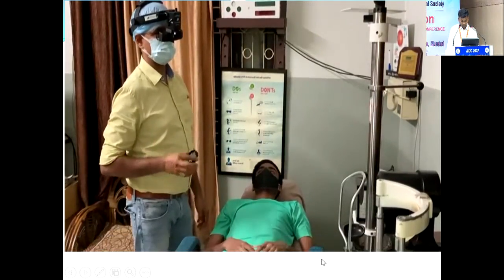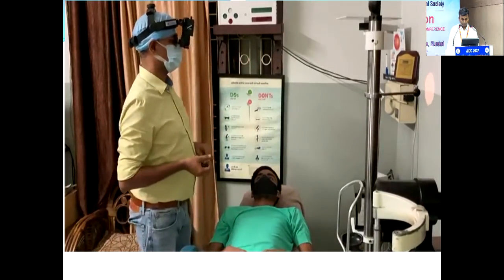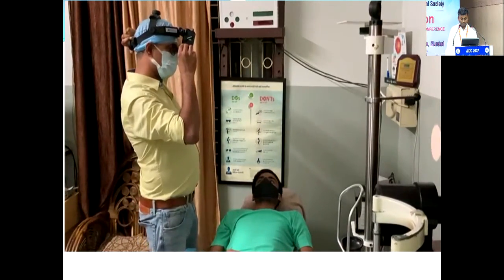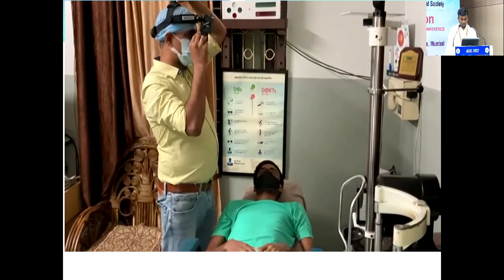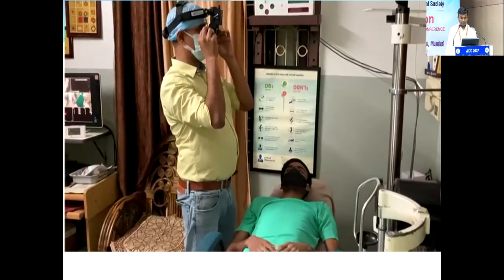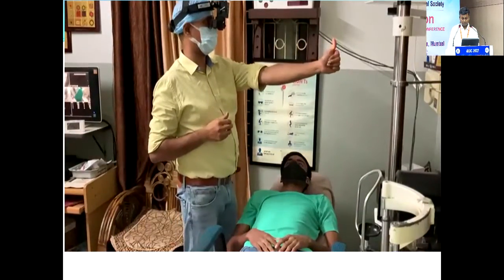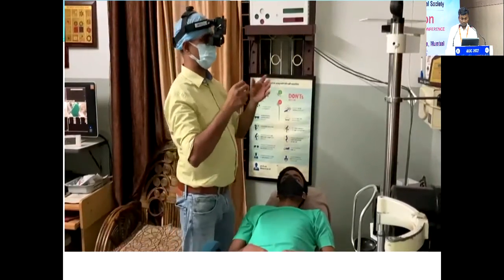The optics and principle of the indirect ophthalmoscope. I'll just show how you have to fix the indirect and how you proceed. So first you fix the headgear. You have two knobs, one at the back and one up. This basically fixes the depth, and once it is properly adjusted, then you focus the beam on the wall or on your finger, and after this you have to adjust the IPD so you can have good binocularity.